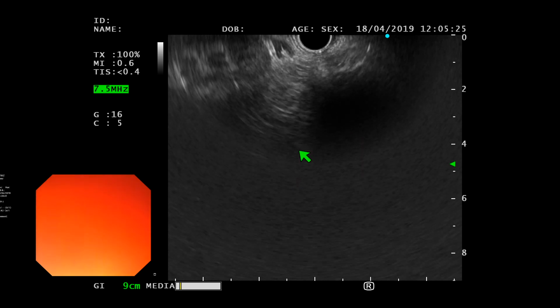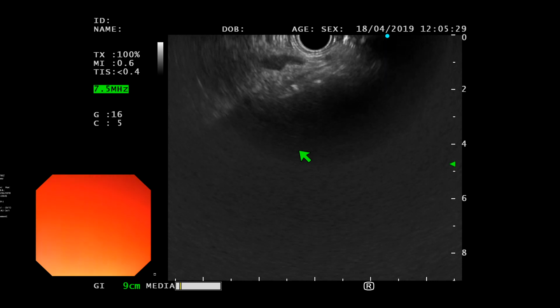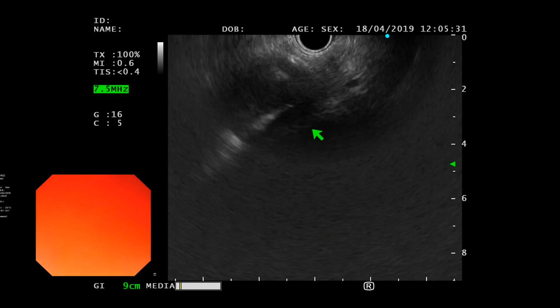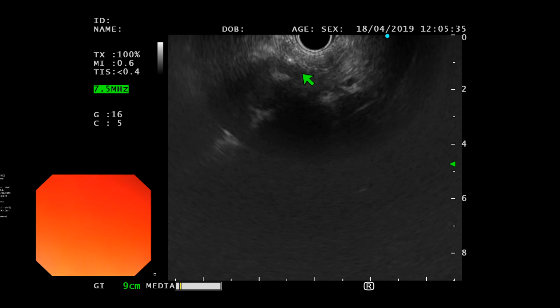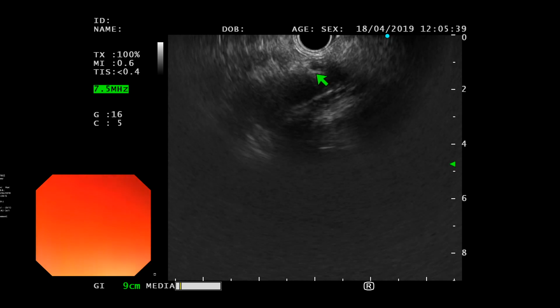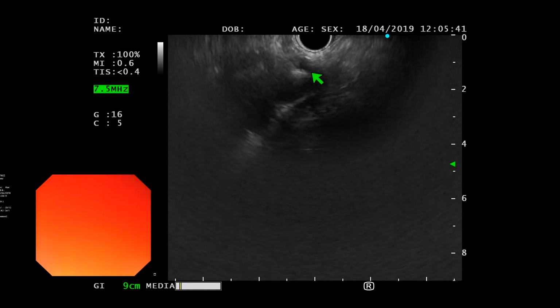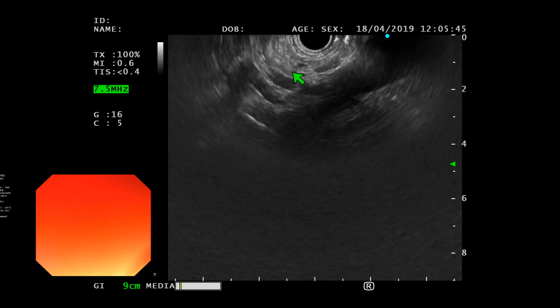Okay? Now if you go opposite, you want to go back towards the midline. So you undo what you just did. So counter, there you go. Now you have your celiac. Show me your celiac again. There. Now follow the celiac in. So gently advance, keeping it in view. Relax your big wheel a bit. Advance and go clockwise. And there you go.